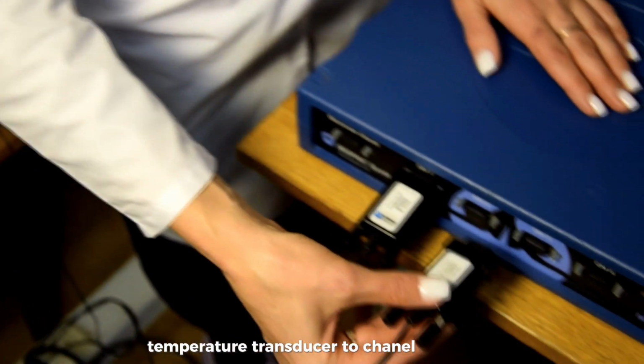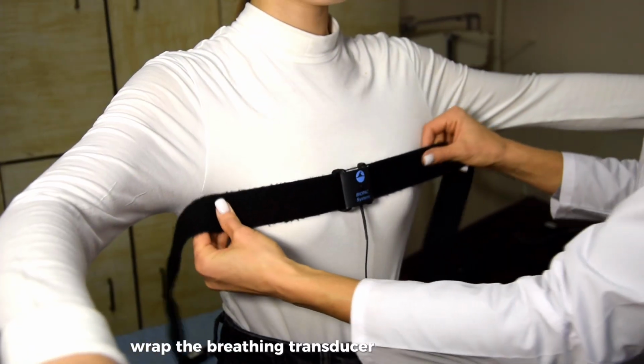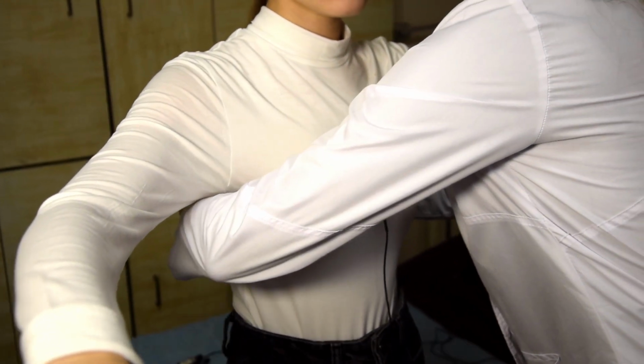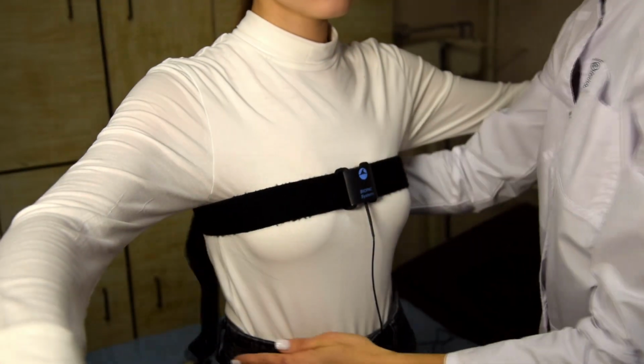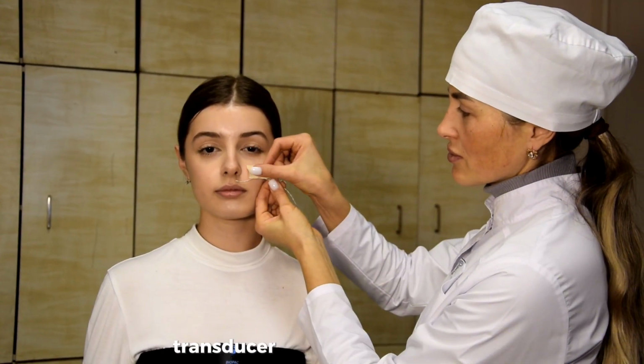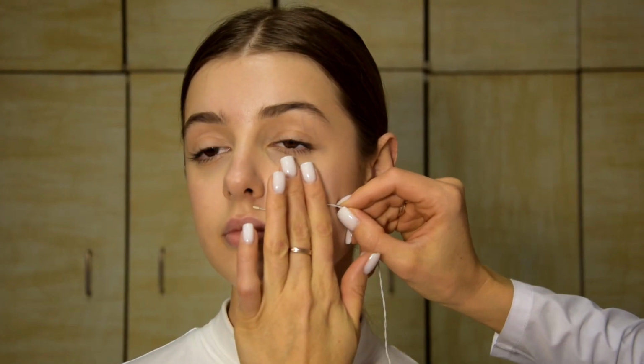Connect the temperature transducer to channel number 2. Wrap the breathing transducer around the chest below the armpits and above the nipples. Attach the temperature transducer to the patient's face.